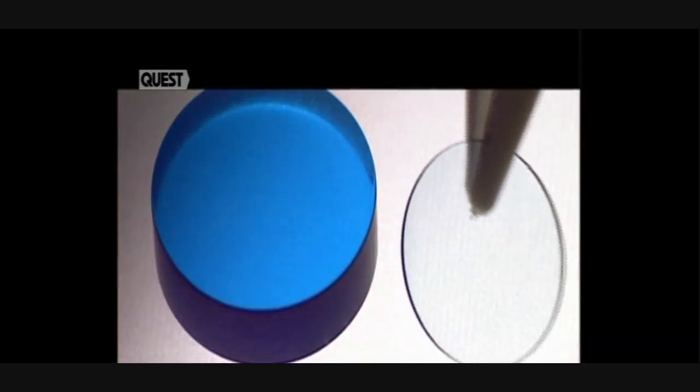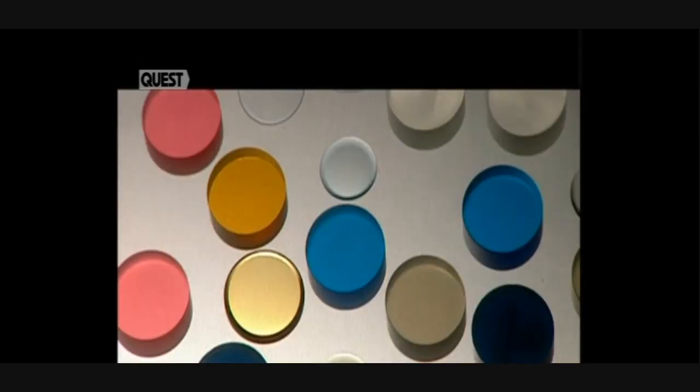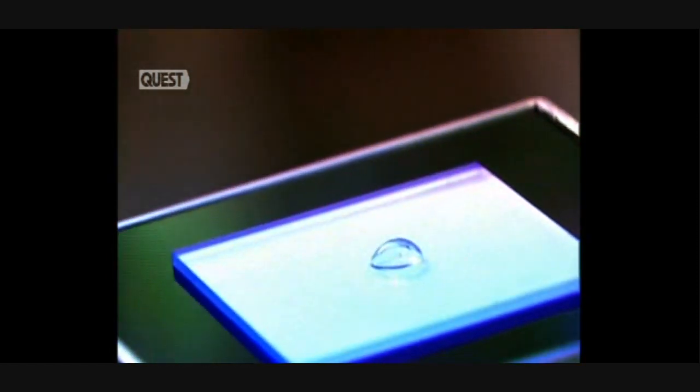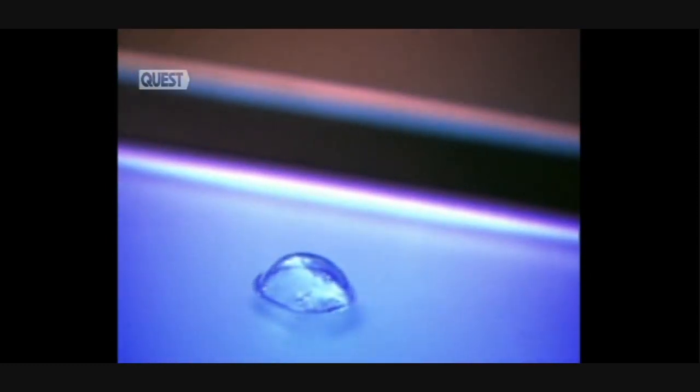Contact lenses — cutting-edge science meets diamond-headed lathes in a surprisingly quick process. Twenty years ago they were seen as space-age and exotic. Now they are an everyday item. The squeamish among us still couldn't imagine having something so closely located to our eyes, but contact lenses have revolutionized the way people see themselves, quite literally.